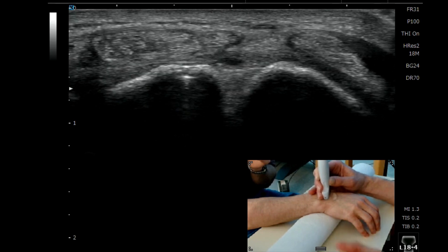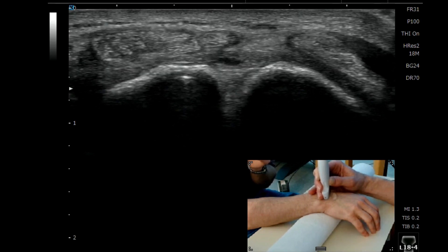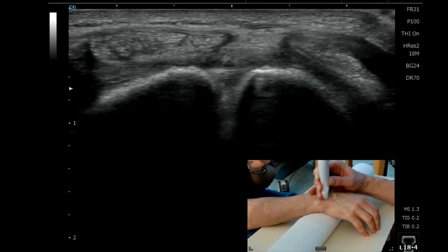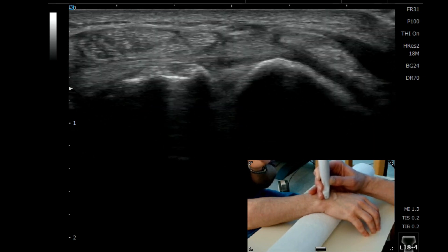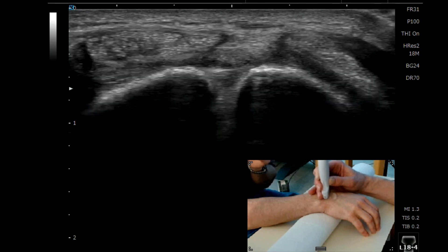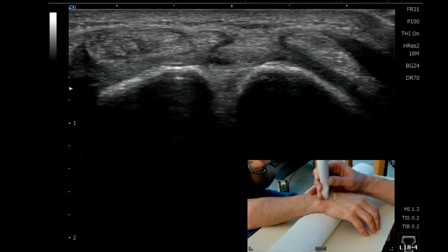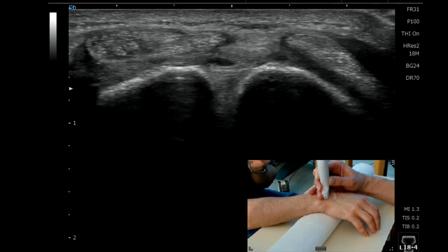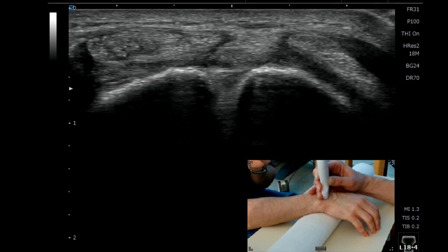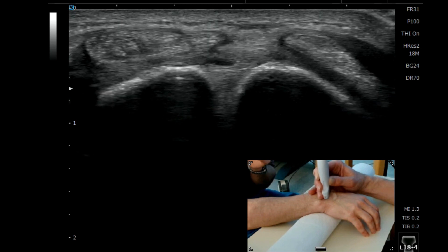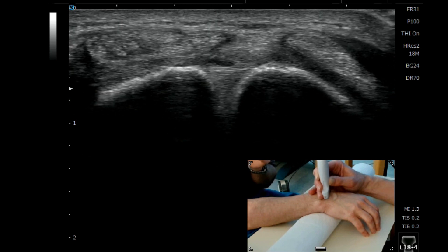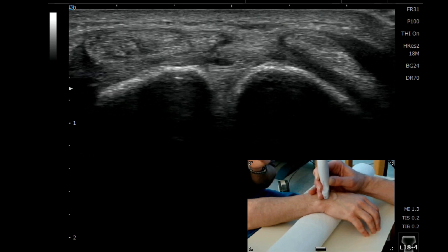And if you come across that region and there's a gap or a loss of normal appearance of those dorsal fibres, then you are probably going to want to go on to further investigate with MRI to assess that ligament in more detail.